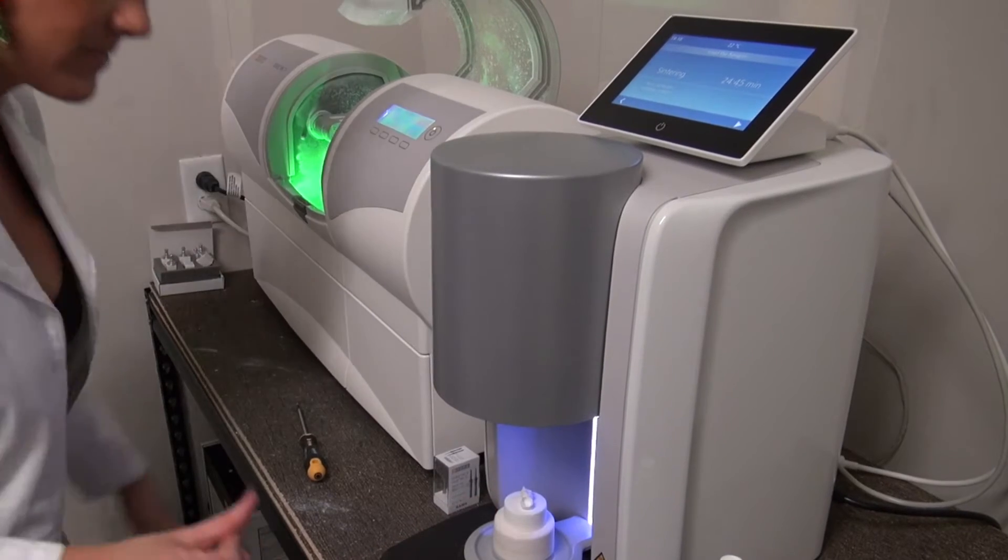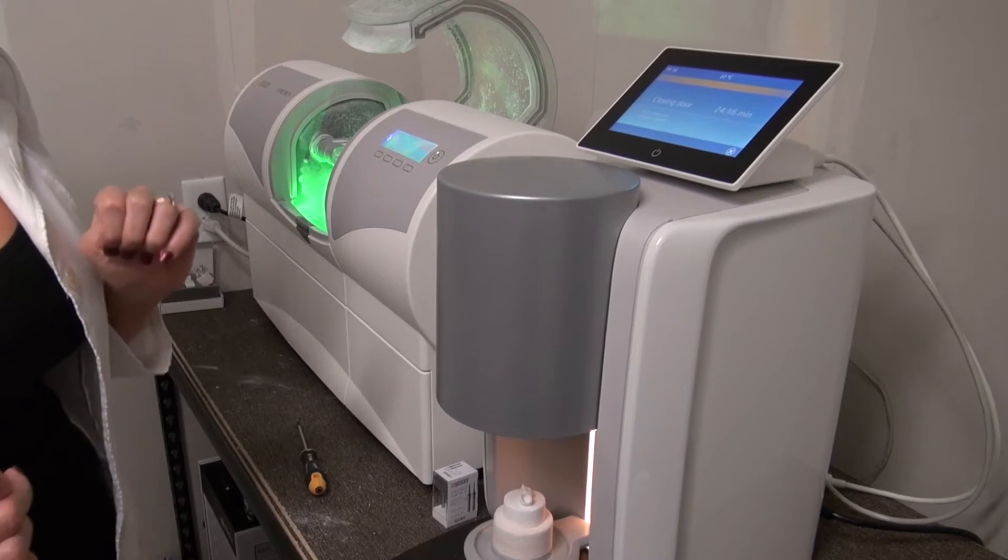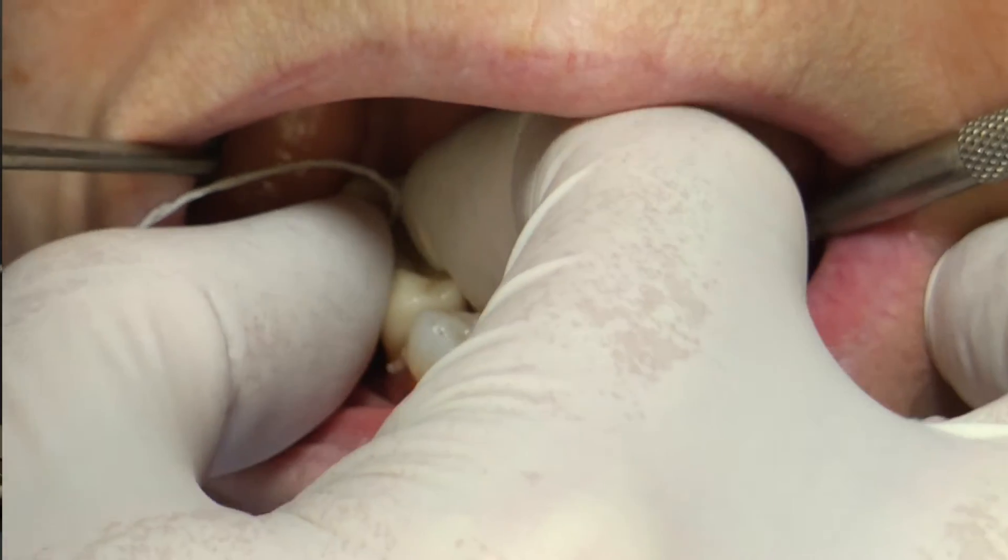The new way of doing zirconia now is so user-friendly. It's easy. It literally tells you from one step to the next what to do. It dry mills, goes straight to the sintering oven, then you have your glaze cycle. And you know what? The little bit of time it adds, you're saving on the other end because you can traditionally cement these in.